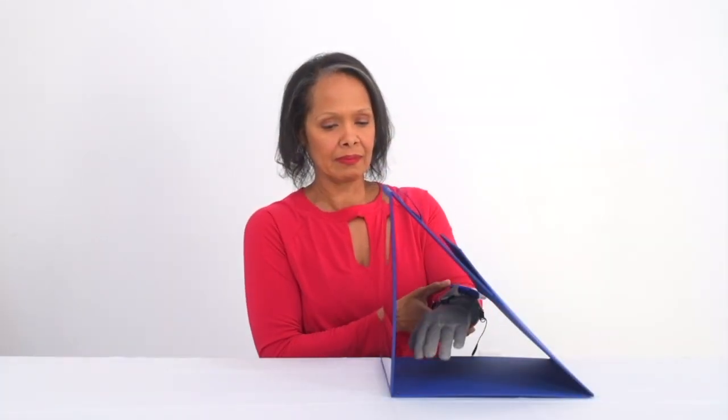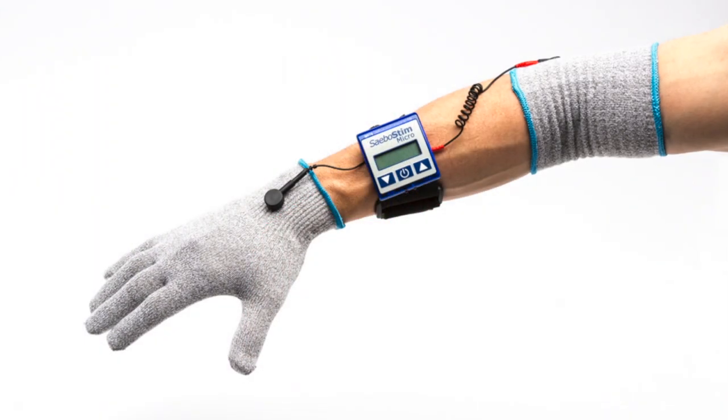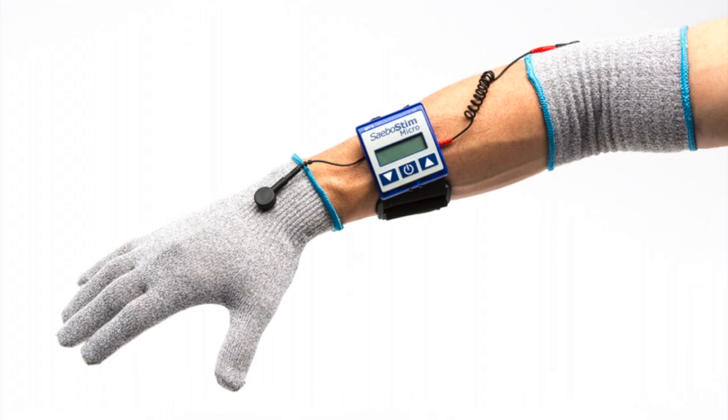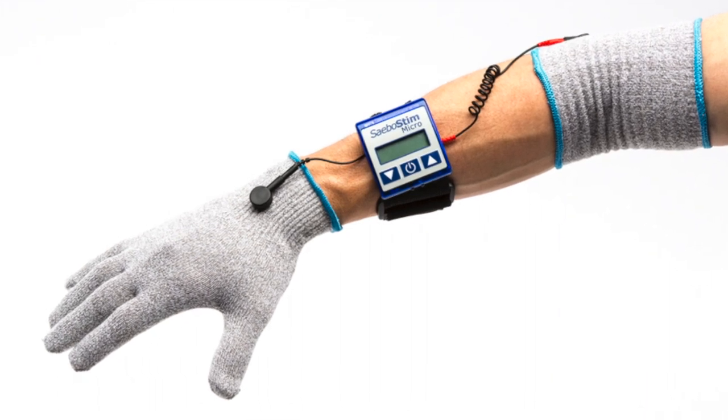To maximize outcomes, sensory electrical stimulation is added using the Sabostim Micro. The Sabostim Micro provides sensory electrical stimulation to the arm and hand using a specialized electro-mesh garment.